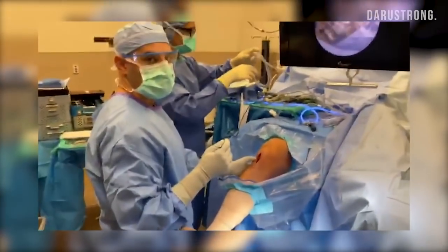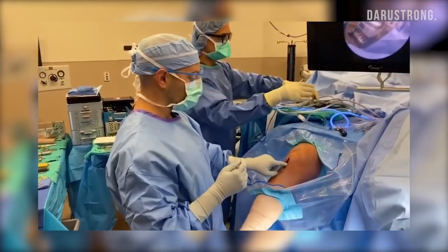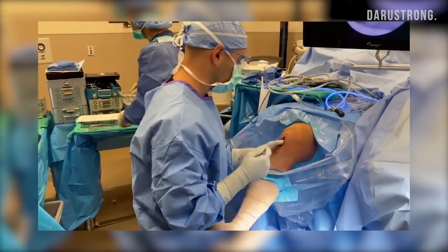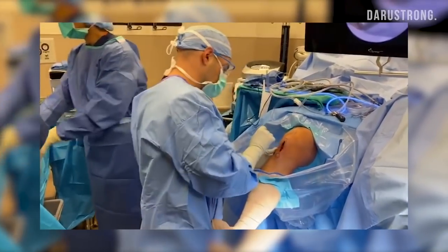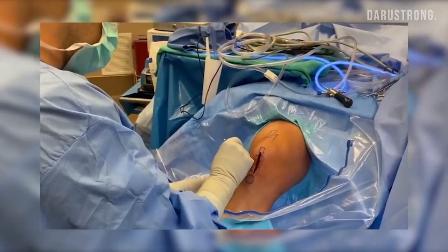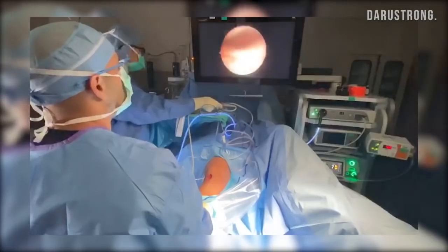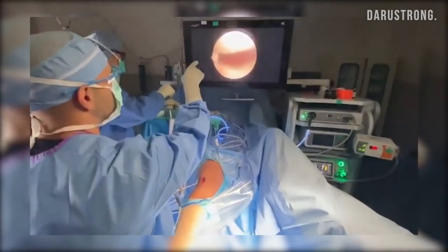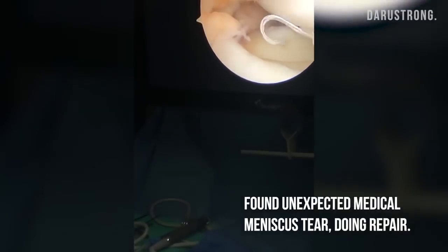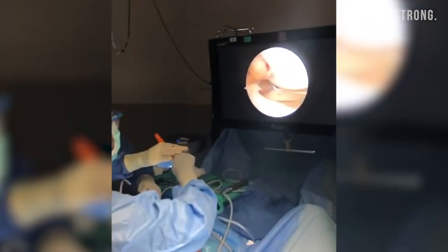While Joe's working on the ACL reconstruction graft on the back table, we're going to start Phil's knee arthroscopic portion. You can see where we harvested the central third of the patellar tendon — we'll leave that open until the end of the case. Now I'm feeling for that lateral soft spot here where we're going to stick in our knee scope. We'll make an incision right here and introduce our arthroscope into the knee. We're going to drop the lights in the room. We're here in the patellofemoral groove — that's Phil's patella, that's his trochlear groove. Let's go inside the capsule. You can see our suture now, and I'm going to very carefully come right above it — right there, that's exactly where I want to be.